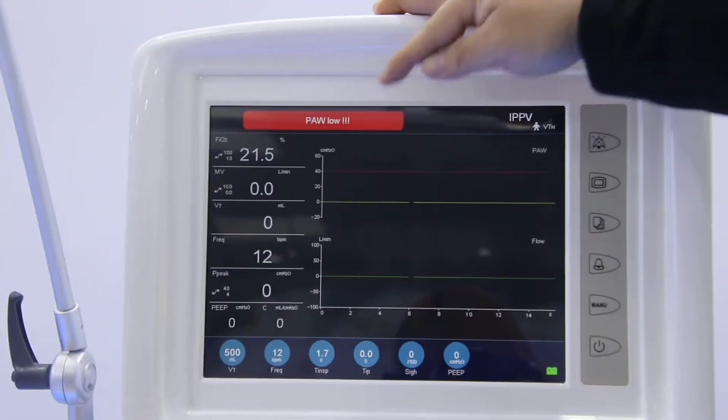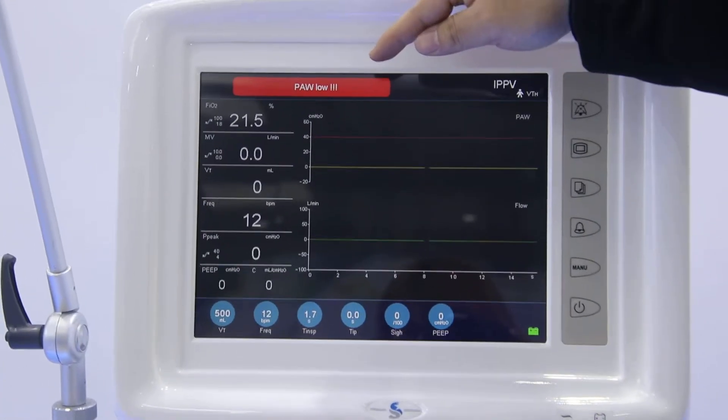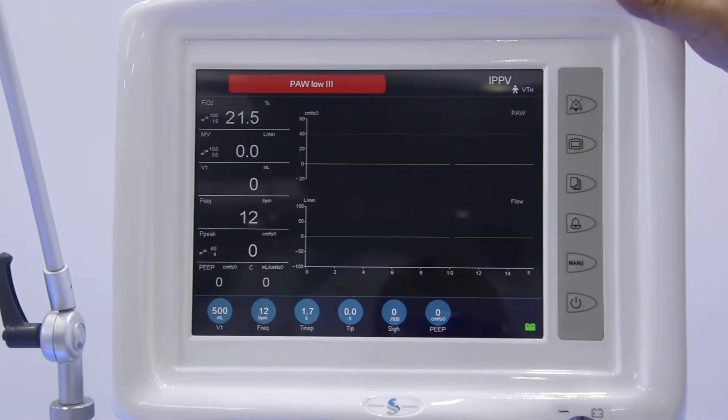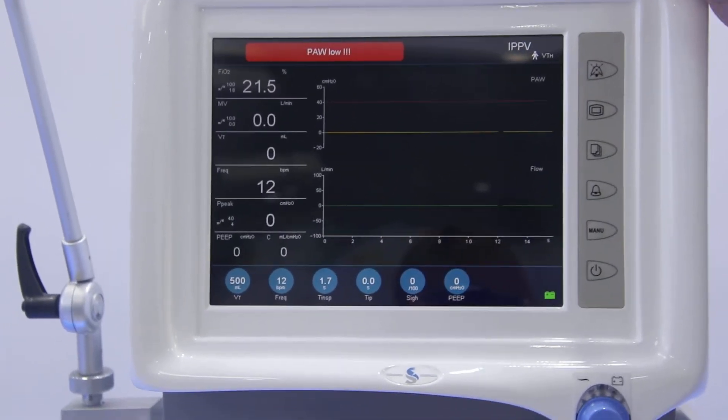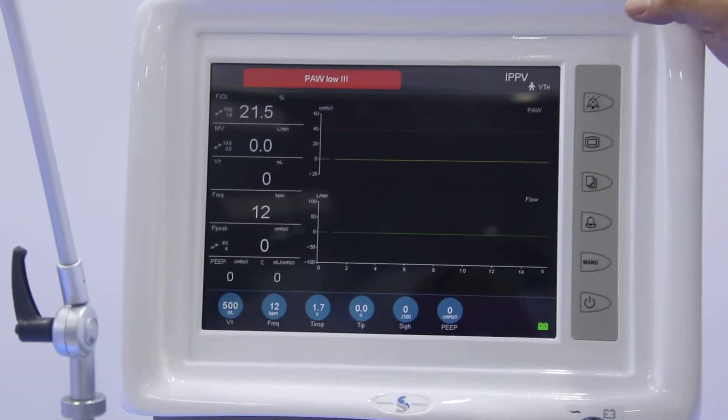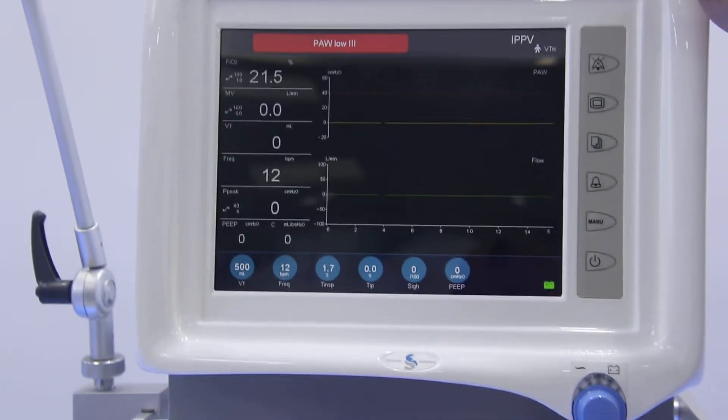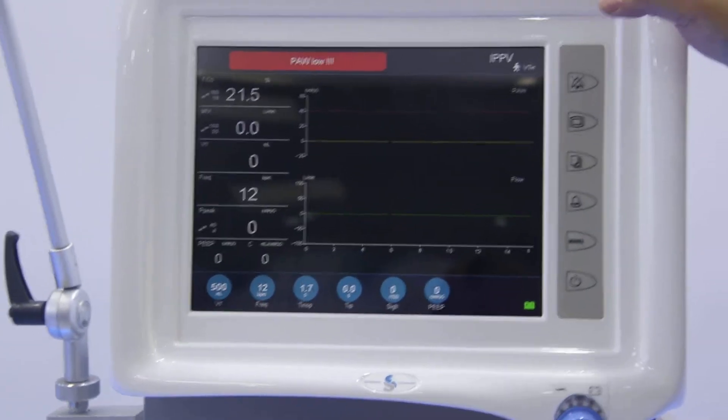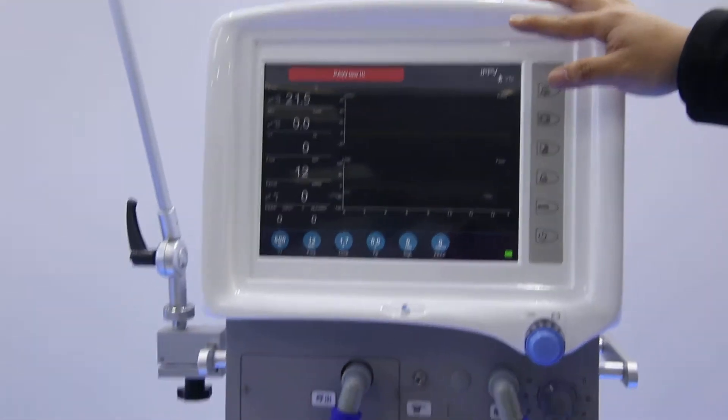On the above side here is the alarming area. The alarming area is separated into two colors, the red one and the yellow one. And also for the voice frequency, we have totally three kinds you can hear. And the most urgent frequency will be the first level you need to solve the problem, and also with the red color.